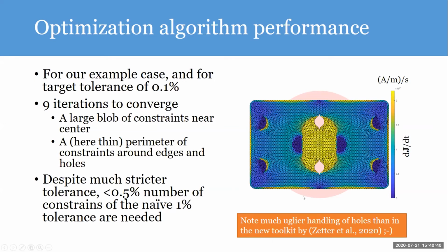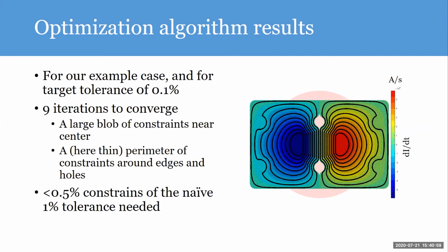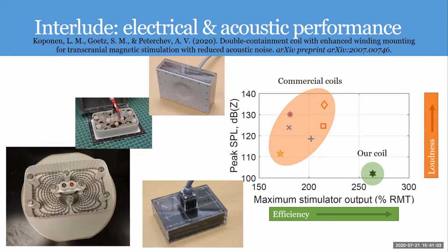And also my hole handling is ugly compared to Rasmus's, so I'm just doing it also iteratively with this solution, finding between which loops it will land up and then constraining it afterwards with the iterative solver. So I would definitely change to the Rasmus method the moment I have time to do that. But it just produces nice windings, and when combined with a coil, they do perform fairly well.